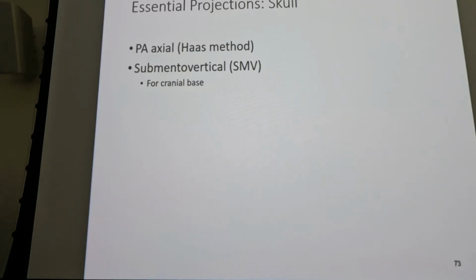Just to illustrate what I was talking about earlier, if you look on page 34, what do you see? What projection is that? The lateral. It's lateral, right. So looking at the banner at the top, what does it say? Skull. Skull, okay. So flip over to page 55, and what does the banner at the top say?